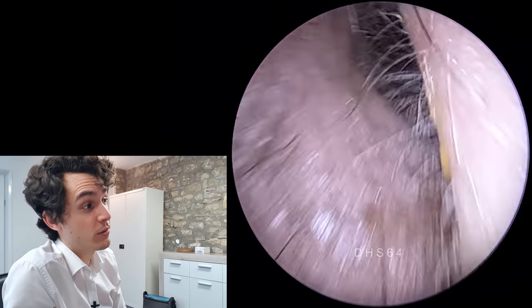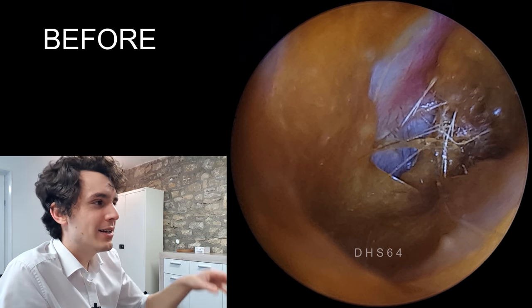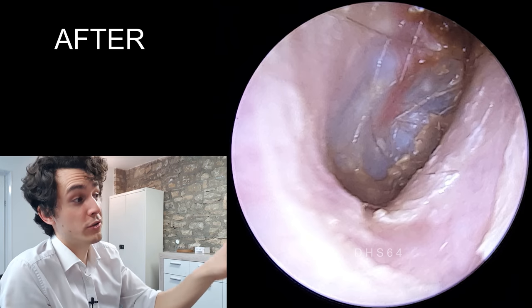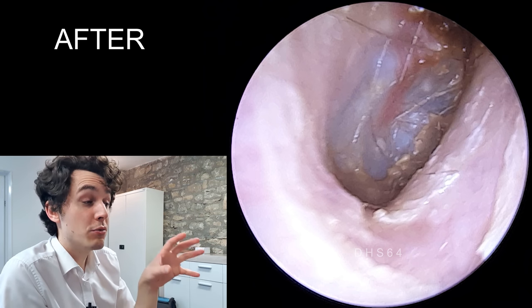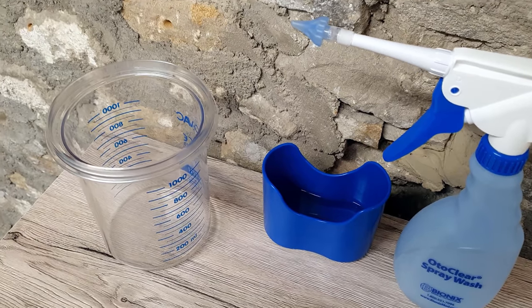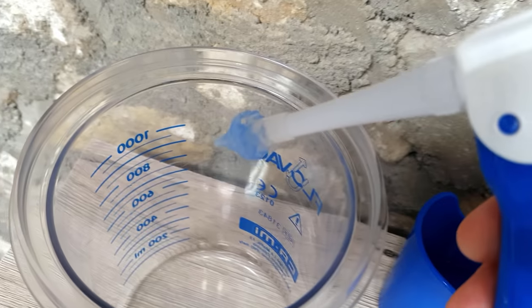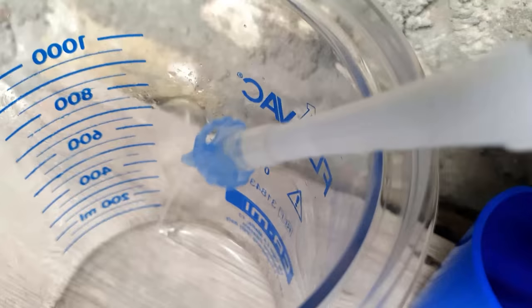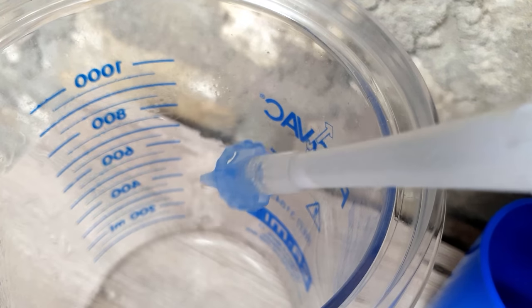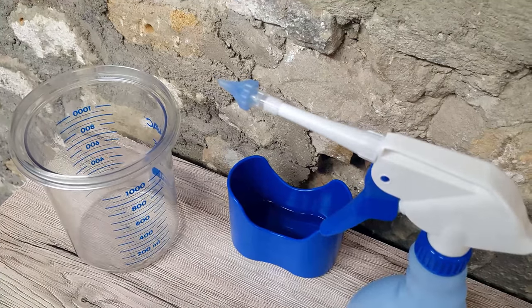There's the before shot — an absolute quagmire in there, with only the central part of the drum visible. And there's the after shot — significantly better. I would not have been able to achieve that without irrigation. So there's the equipment: the kidney bowl — the blue cup. As I pull the trigger, just watch what comes out at the end — you can see it's coming out in a tripod motion. I could really put a lot of force into the trigger to cause a lot of pressure, but I tend to go fairly easy with it.